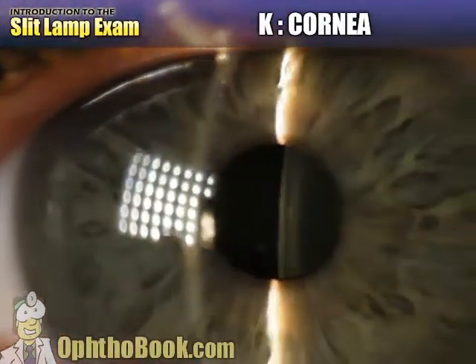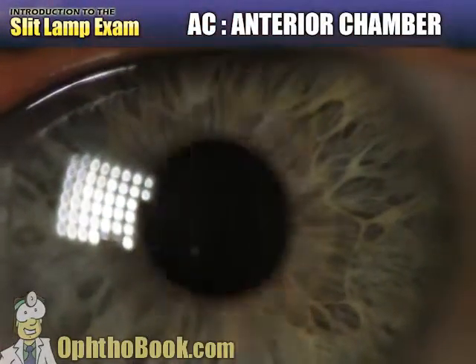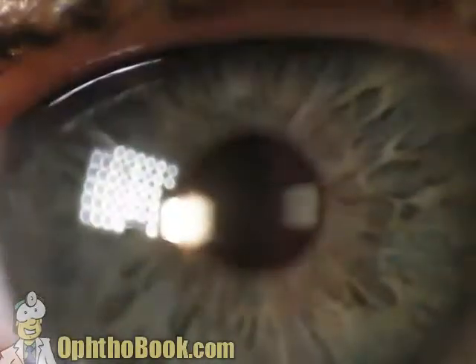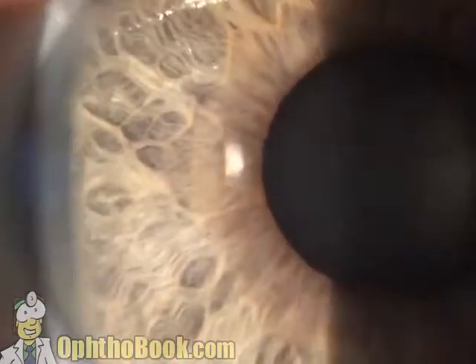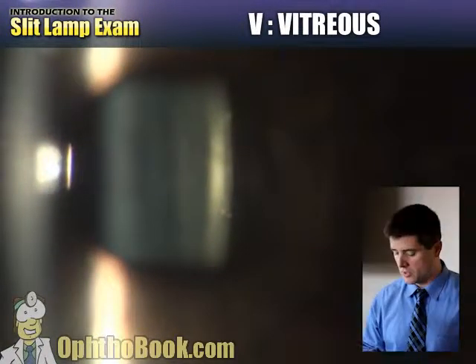Then we look at the cornea — making a very thin slit of light, sweeping across — looks clear, no problems. The anterior chamber: make the beam shorter, a little bit wider, use the pupil as a black background — looks deep and quiet. Then the iris, the easiest part to look at — you can bump your magnification up, but not a lot of pathology usually. Looking at the lens, once again we make a very thin slit beam to look at this clear structure — you can see the front and back of the lens, and behind that is the vitreous, which looks like a dark cavity.